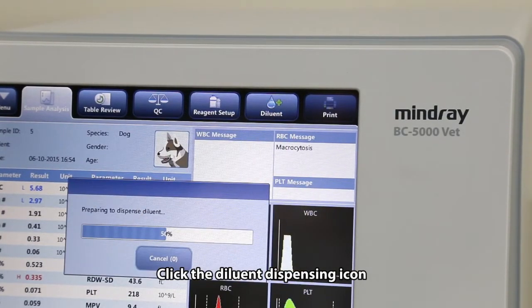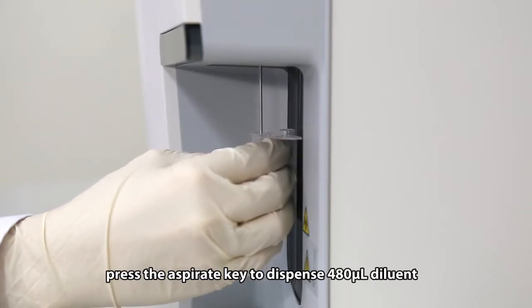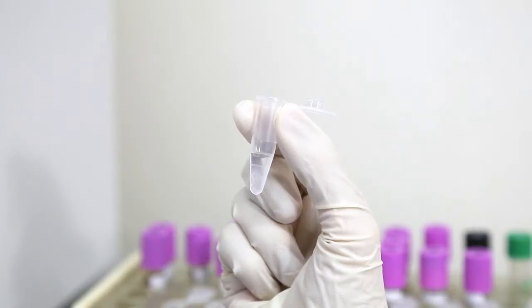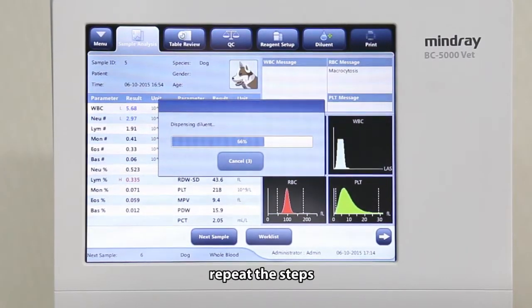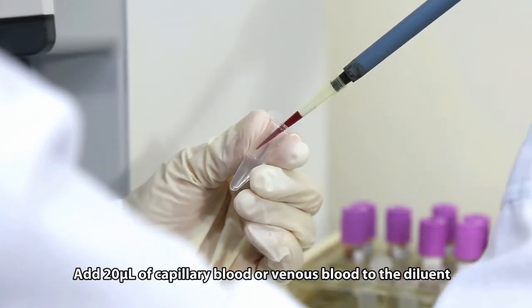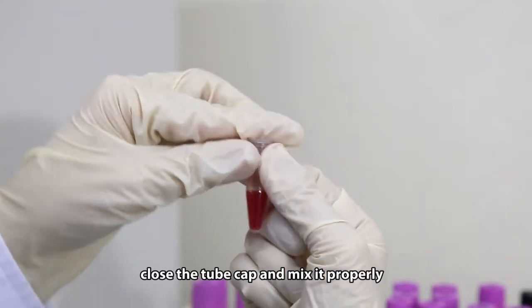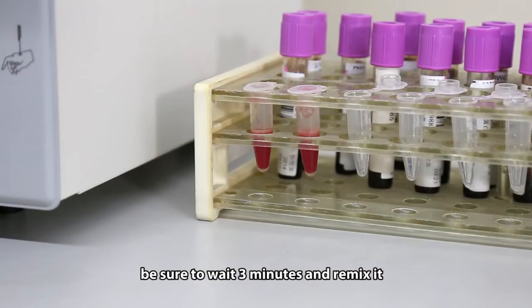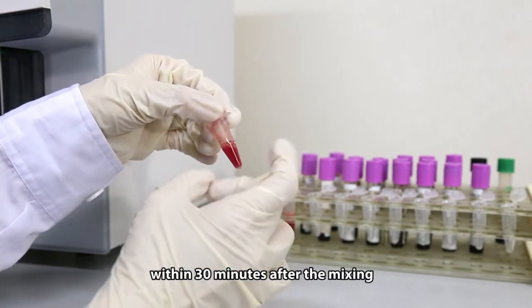Click the diluent dispensing icon, then present a clean tube to the sample probe. Press the aspirate key to dispense 480 microliters of diluent. To continue with diluent dispensing, repeat the steps. Click cancel after preparing all the diluents. Add 20 microliters of capillary blood or venous blood to the diluent. Close the tube cap and mix it properly. After mixing the capillary sample with the diluent, be sure to wait 3 minutes and remix it before running the pre-diluted sample.